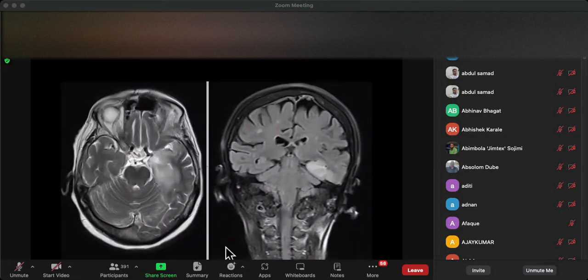Okay, this patient presents with confusion and pyrexia, middle-aged female. Yeah, HSV encephalitis, temporal lobe involvement, doesn't tend to involve the basal ganglia, so it stops in the temporal lobe, and this was herpes simplex encephalitis.